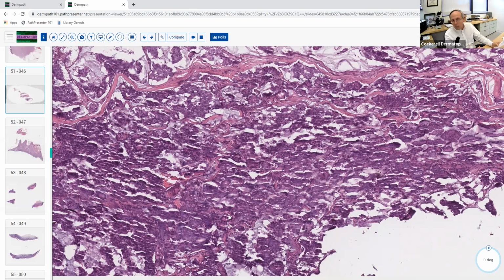Well, nobody chose that. I mean, clearly there's a neoplasm here. It's not a cyst. It's not just focal cutaneous mucinosis either, which is basically analogous to digital mucus cysts. It's not a mucocele. Again, we saw that earlier, which is just basically a lot of mucin with normal ducts and some mucophages in there. It does not have this type of neoplastic process.